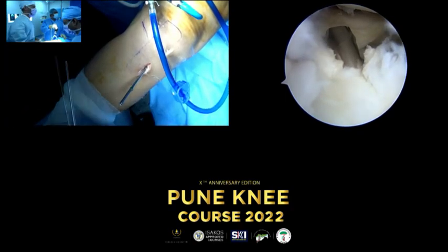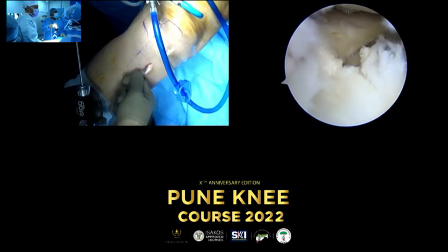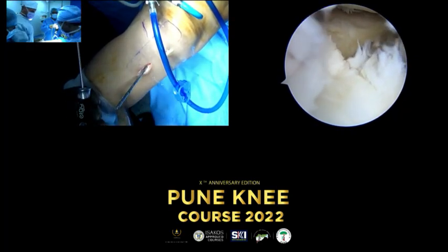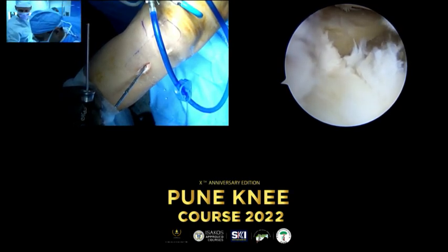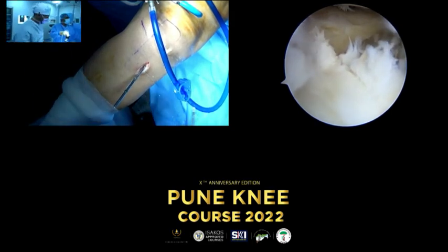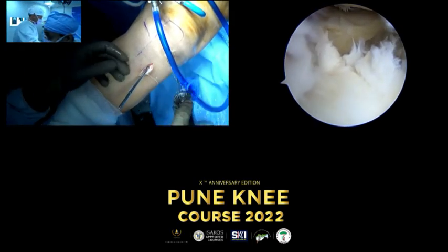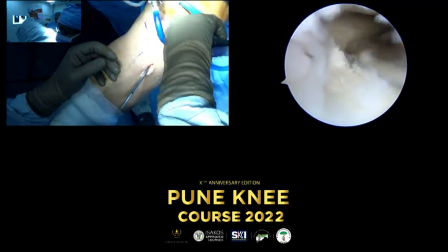Okay, I take it out, but I need a suture passer. Do you have one? Yes. Give me the number one, the same, with the loop, right? Yes, number one. I resect this tissue.